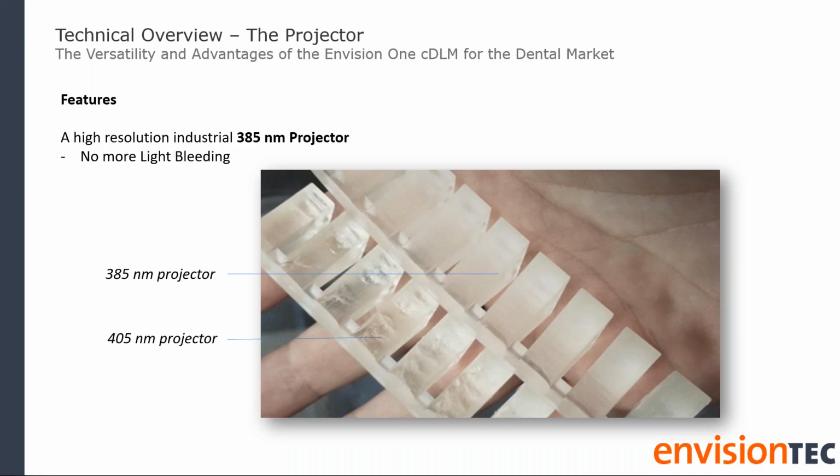This is due to the 80% cured green model that is produced by the printer. With 20% of the model left to cure, this allows for a higher chance of shrinkage and curl during post-processing. With 385 nanometer wavelength, the green model is cured to about 96%, which leaves only 4% to cure during post-processing. This reduces the chances for curling by about 5 times.